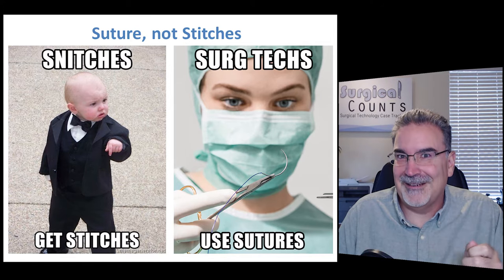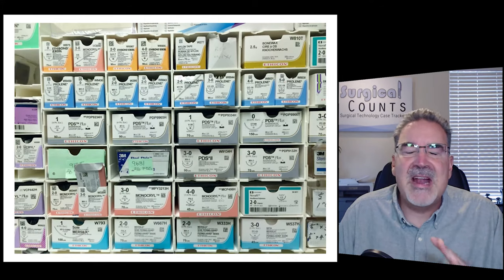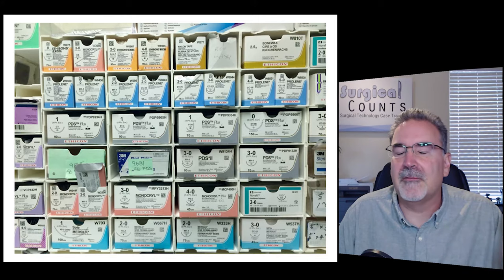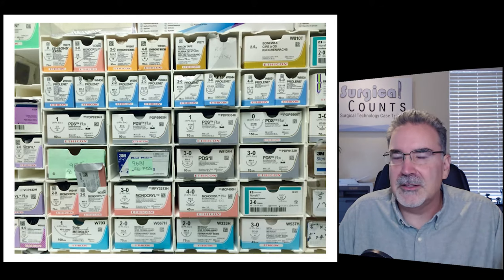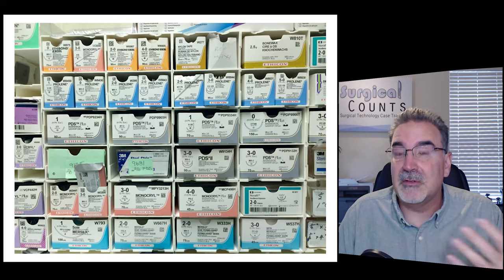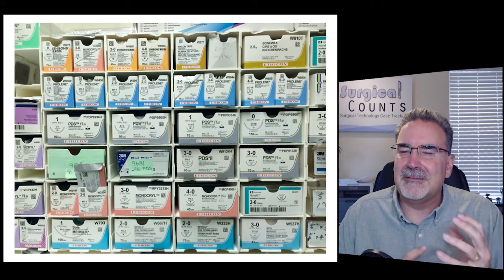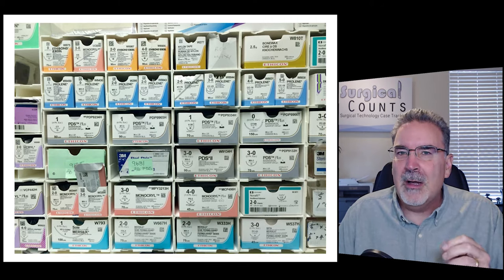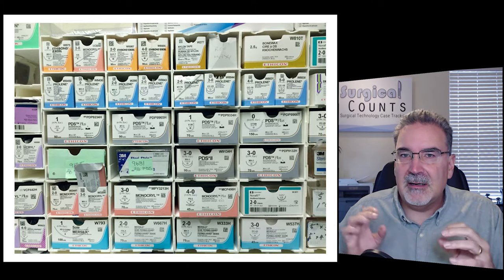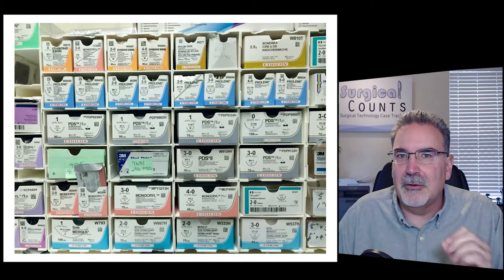got it? Okay. Now, when it comes to suture, there are many, many types of suture, many kinds of sutures, all different sizes and varieties to choose from, and different doctors are going to have different preferences for the type of suture that they like to use. So I'm going to try to help organize this and make it a little bit understandable by categorizing some of the suture types into different sections so you can sort of see how they break down just a little bit.